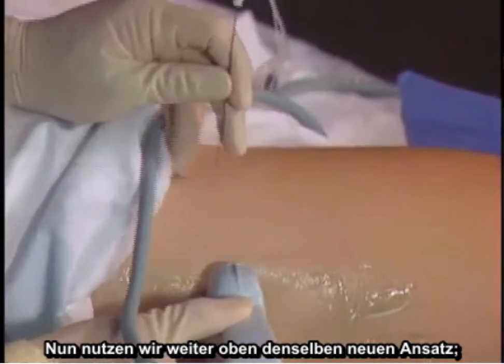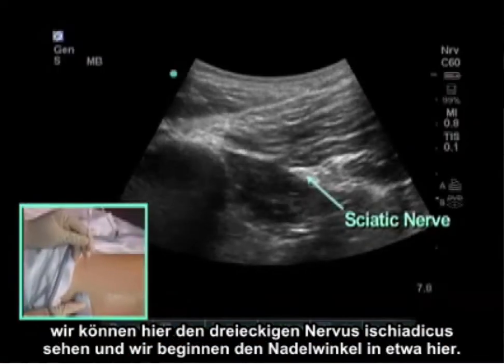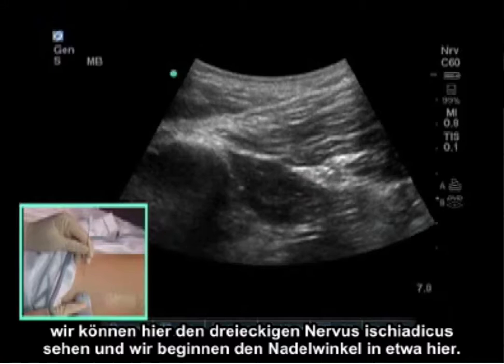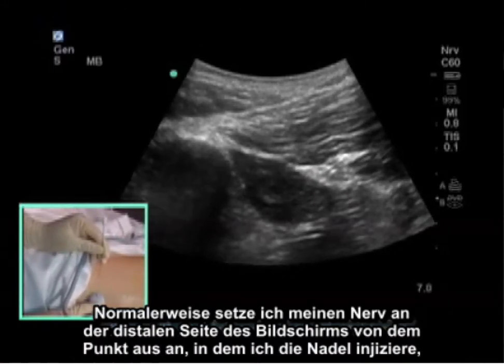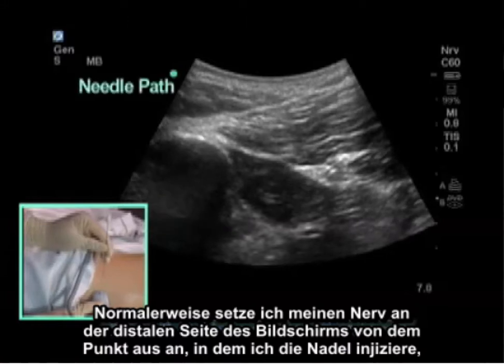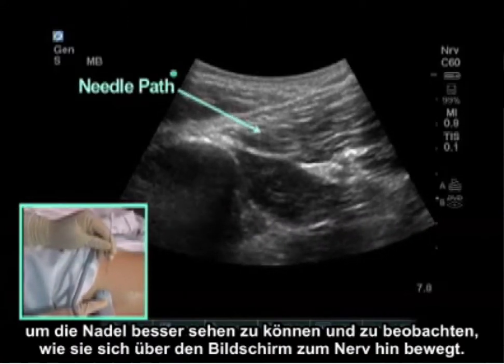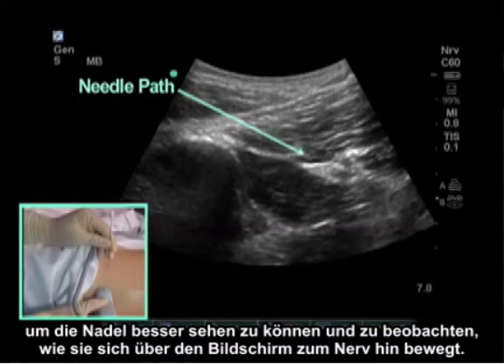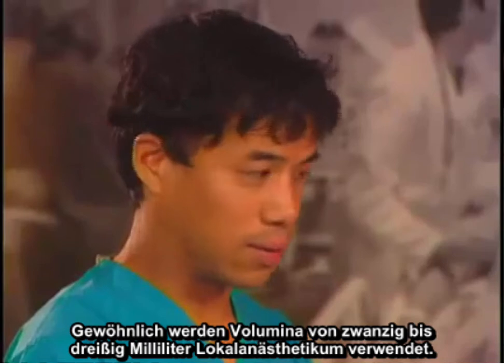Higher up we use the same needle approach. We can see the triangular sciatic nerve here and we start the needle angle accordingly. I typically put the nerve on the distal side of the screen from where the needle is entering, in order to see the needle better as it travels across the screen to the nerve. Typical volumes are 20 to 30 milliliters of local anesthetic.